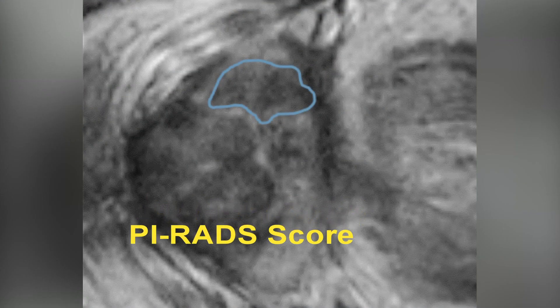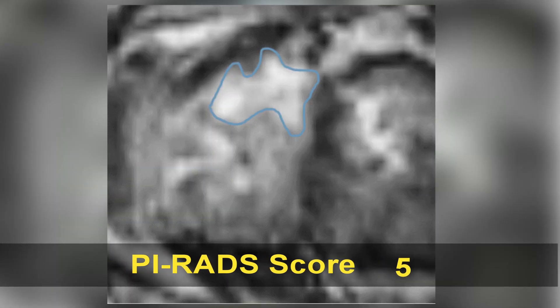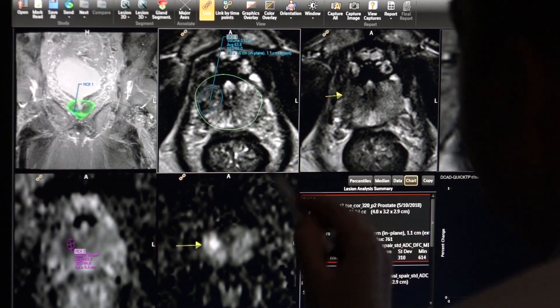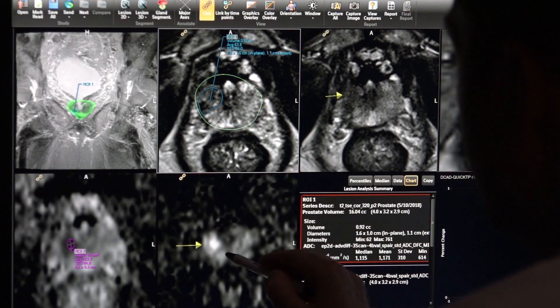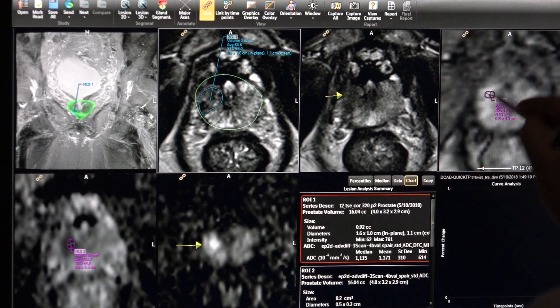This particular example is a PIRADS-5 lesion. The PIRADS score indicates the likelihood of that lesion containing cancer — the higher the score, the more likely a cancer. For example, this PIRADS-5 lesion has approximately an 80% chance of containing a cancer. This lesion is then contoured in 3D, which prepares this set of images for co-registration with MRI ultrasound fusion to guide targeted biopsy.